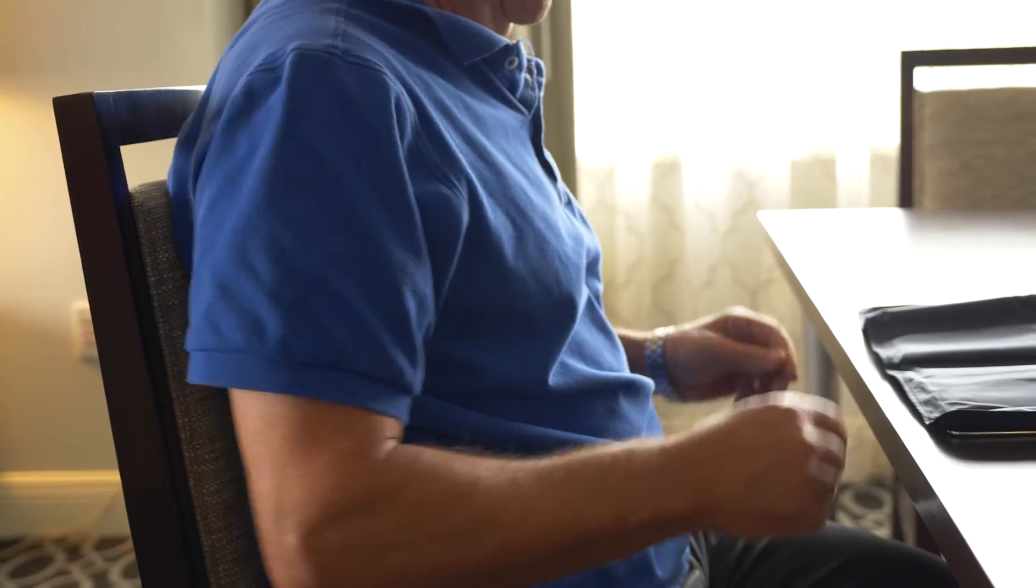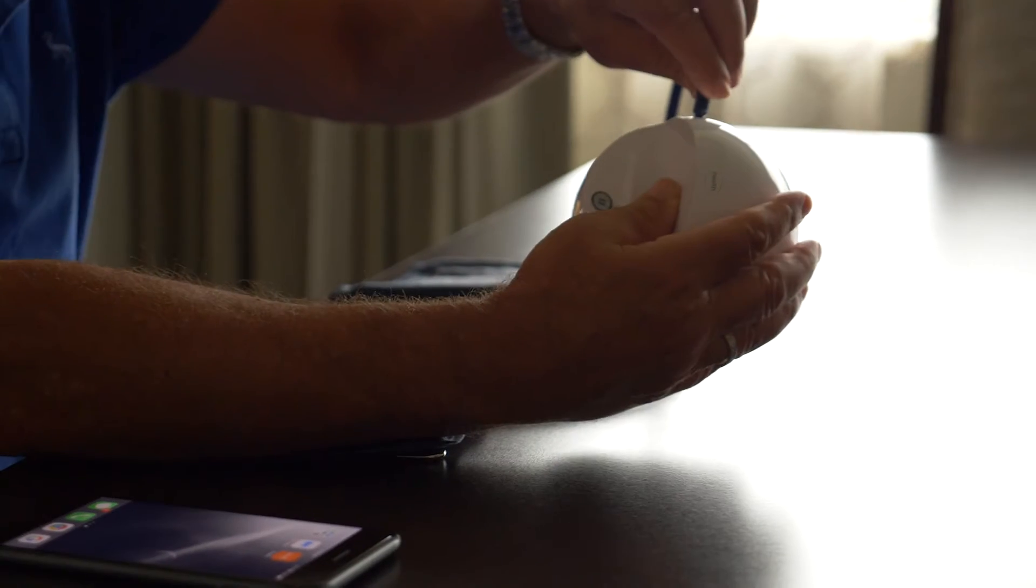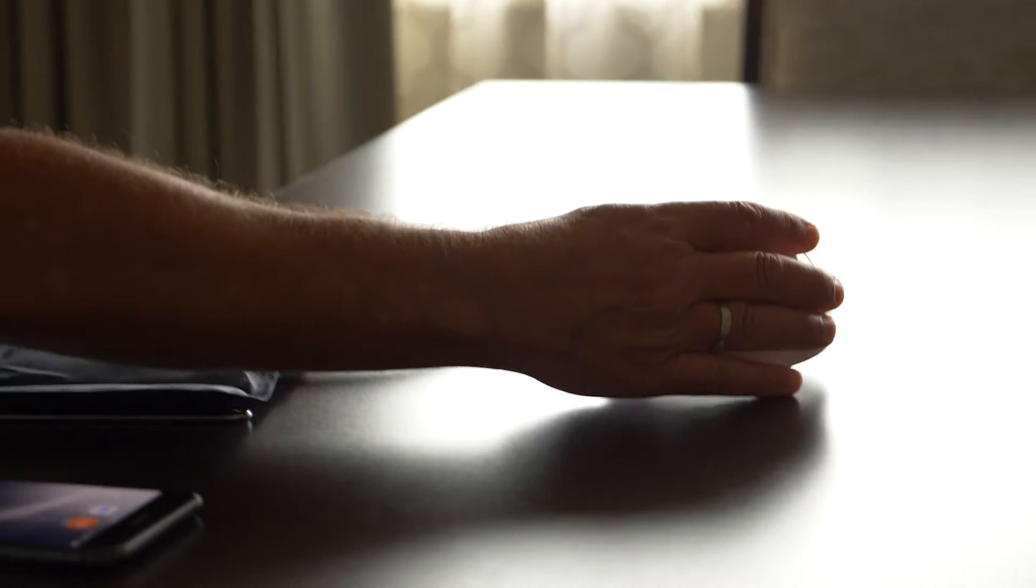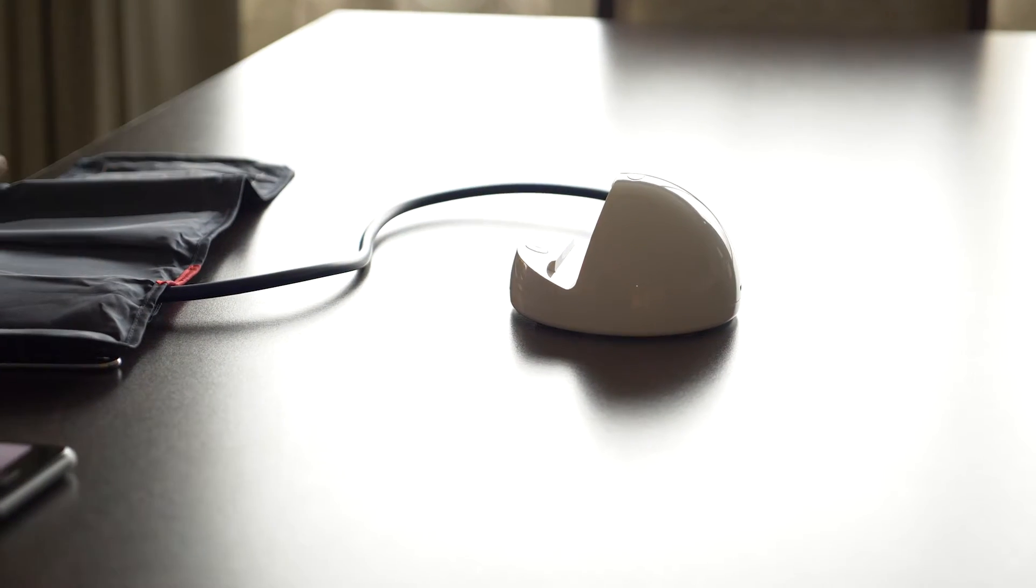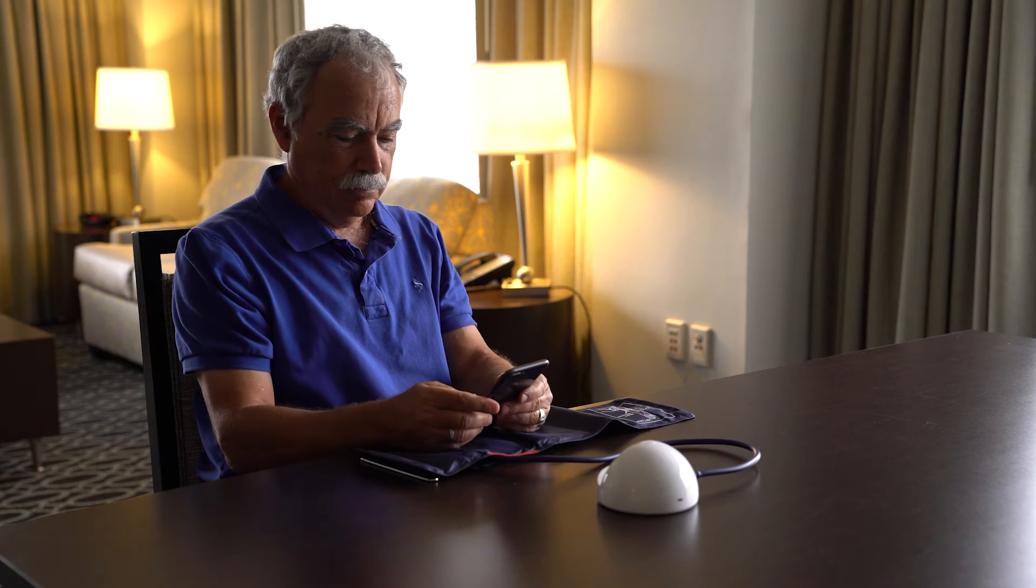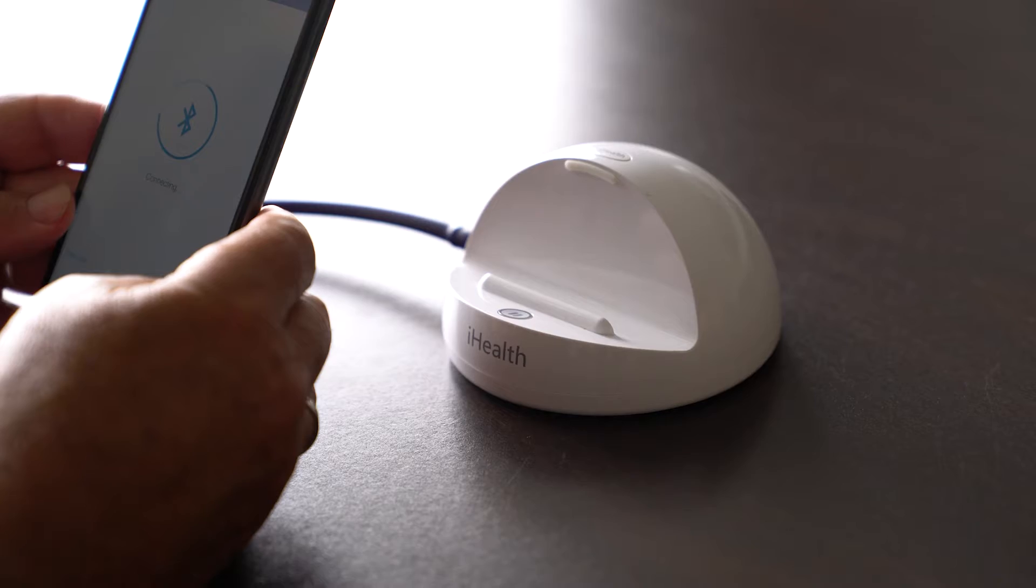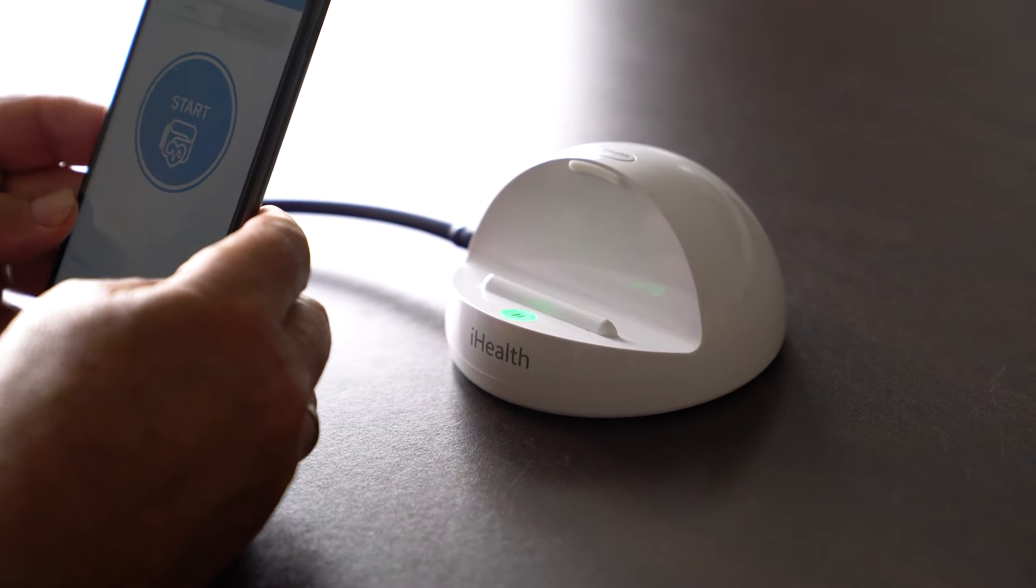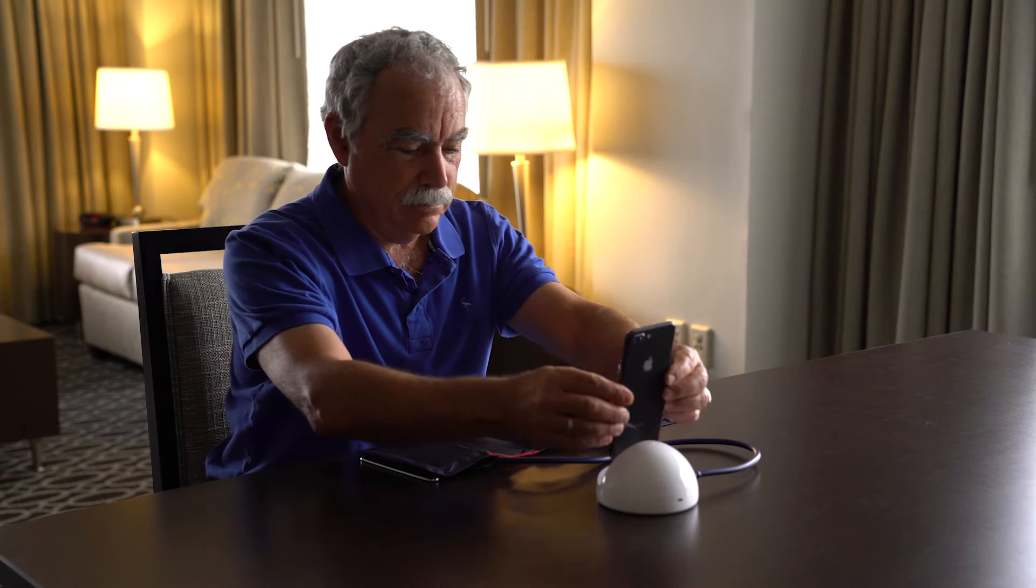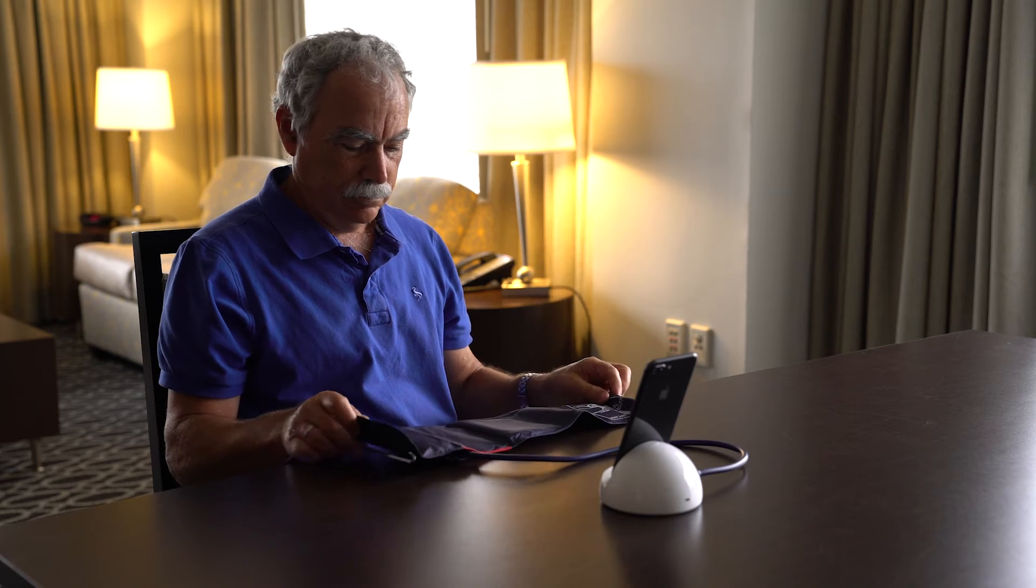If you have not already, connect the cuff hose to the dock and verify the Bluetooth is enabled on your smartphone. Then, open the application. It will take about three to six seconds for the monitor to connect with your smartphone. The green light on the dock will light up to indicate that it is connected. If you see a red light, your dock has a low battery and you'll need to plug your dock into an outlet before continuing.